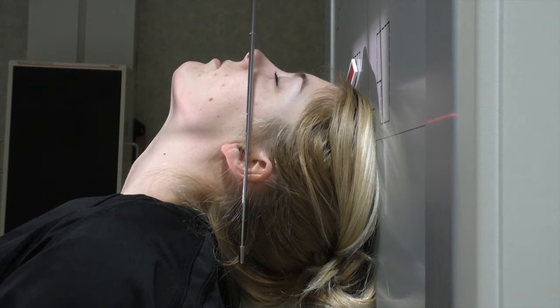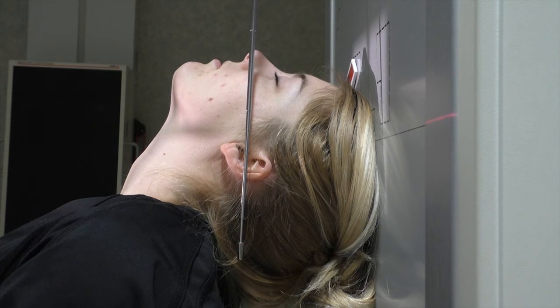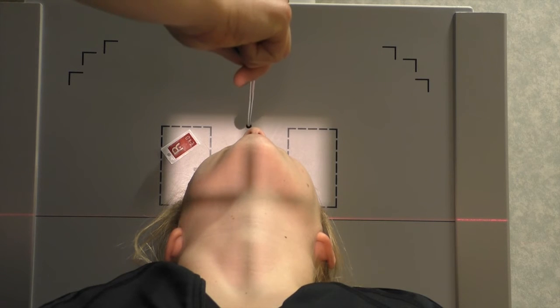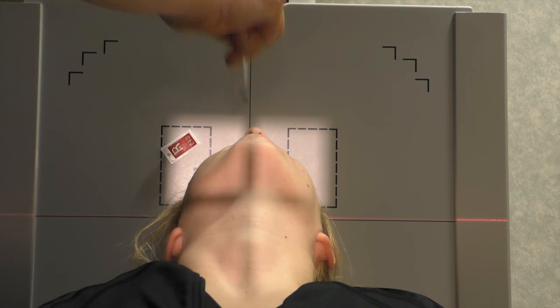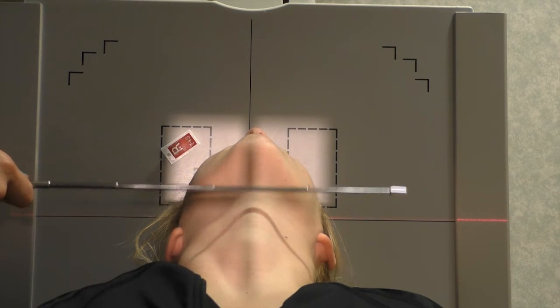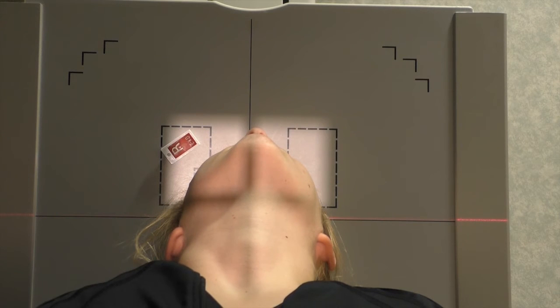For the SMV, raise the chin and hyperextend the neck until the IOML is parallel to the IR. The central ray is aligned perpendicular to the IOML. For the SMV, the mid-sagittal plane is perpendicular to the IR, center 2 inches inferior to the mentum at the level of the mandibular angles. Collimate around the area of interest. Marker is placed on the correct anatomical side.